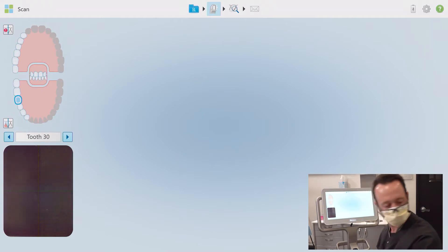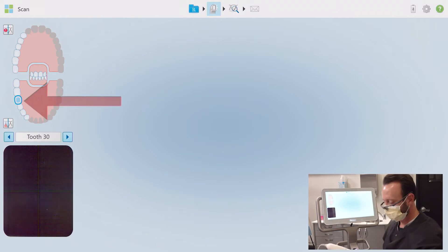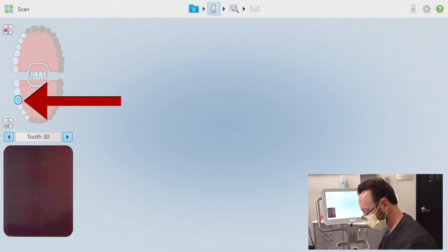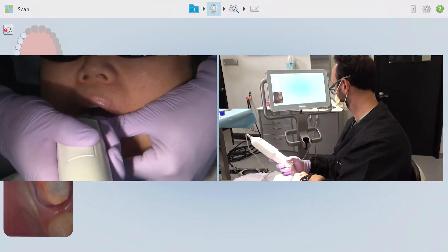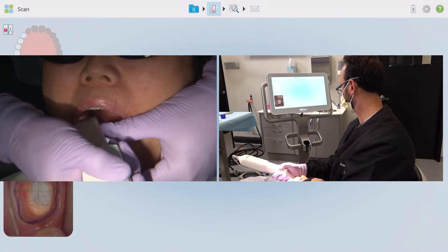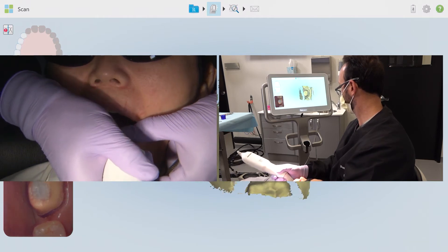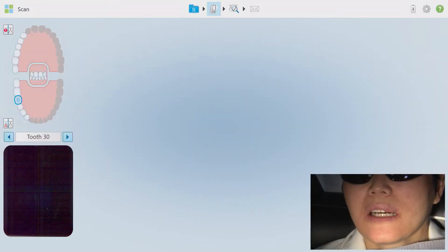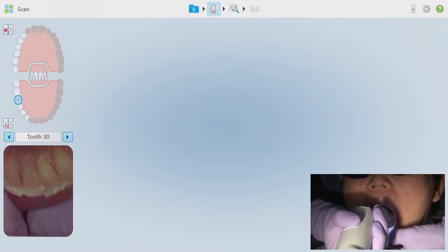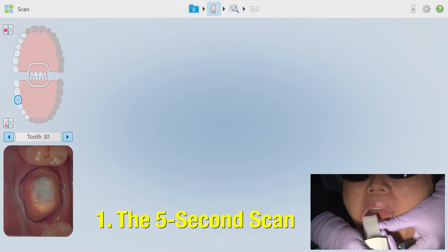All this work we've put into tissue retraction and hemostasis needs to be taken advantage of immediately. Click and select the tooth preparation — it's colored in blue here on this chart — and then prepare for your first scan. Take a look at my hand position and setup before we get started: I'm holding the wand at the base with my dominant hand, palm towards the ceiling. I'm seated at 12 o'clock in relation to the patient and the iTero is set up at either a five o'clock or seven o'clock position.